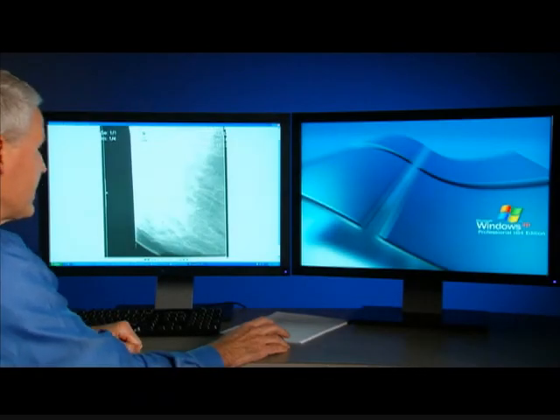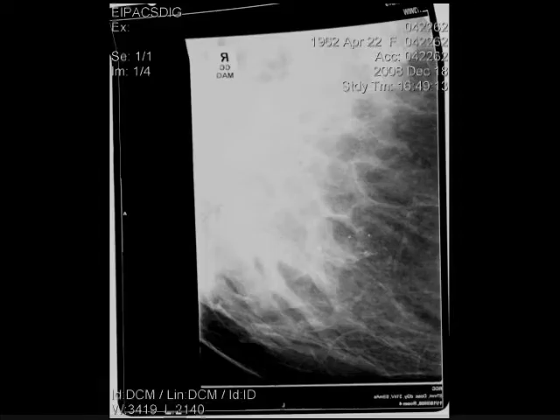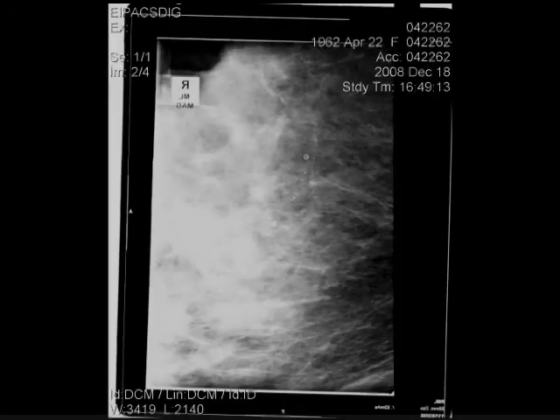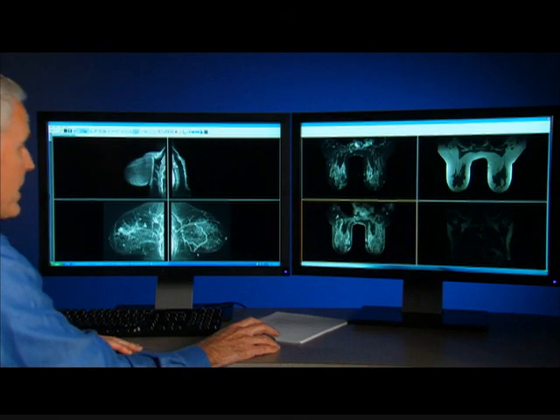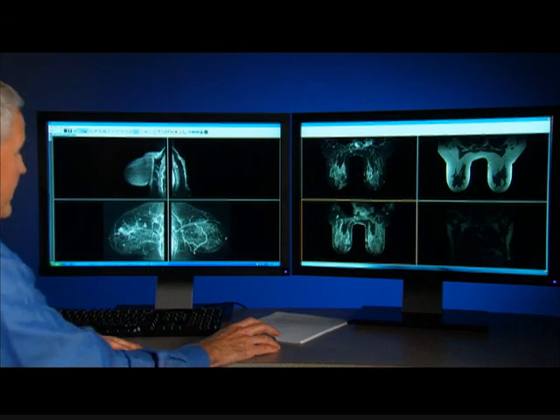Our next case is a patient in her late 40s who presented for a routine screening mammogram. On the mammogram, which I just show a couple of magnification views, there was a cluster of abnormal microcalcifications within the breast. There were no additional significant calcifications noted, although the patient did have moderately dense tissue. This patient underwent a stereotactic biopsy, which did reveal ductal carcinoma in situ, and came to MRI to assess extent of disease prior to her surgery.